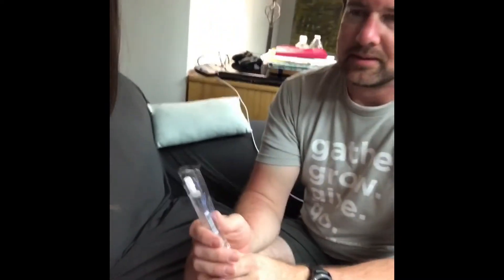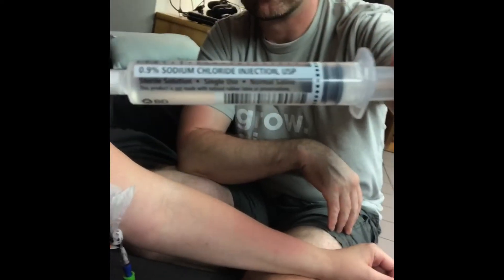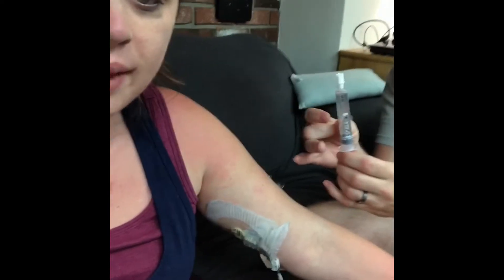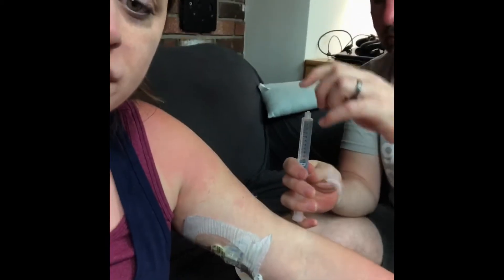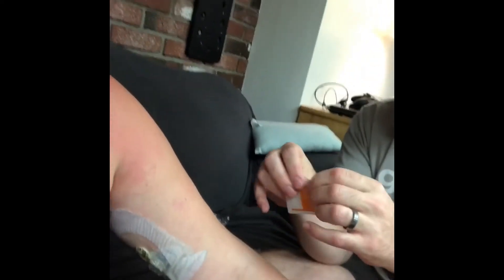Here is Nurse David — he got a little too much sun yesterday. He's going to hook me up. The first thing he's going to do is inject me with some saline. The method the nurses explained to us is called the SASH method: S-A-S-H, which stands for Saline, Antibiotics, Saline again, and then Heparin. Before hooking up the antibiotics, he first takes a little cap off and then wipes it with an alcohol wipe for 15 seconds.